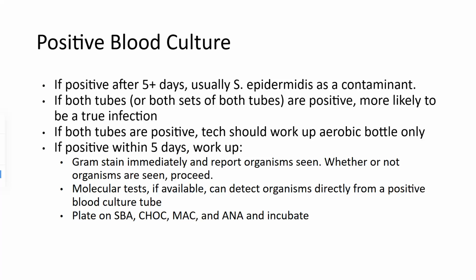Now, we're still going to do the follow-up testing. We're going to do susceptibility testing and all that kind of stuff to figure out what the identification is and the exact antibiotics that would actually work to treat. But because sepsis can turn fatal so quickly, we typically want to give them some information right away so that they can get started on some type of antibiotic treatment in hopes to delay the progression to death. So, gram stain it and then report what you see.